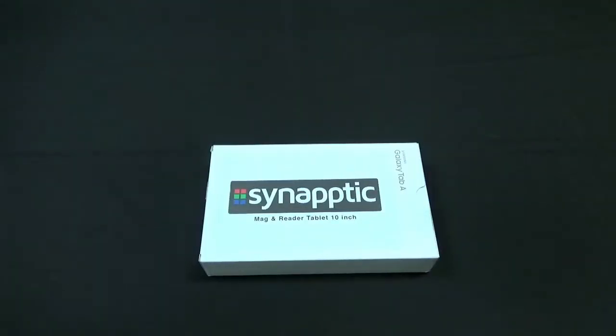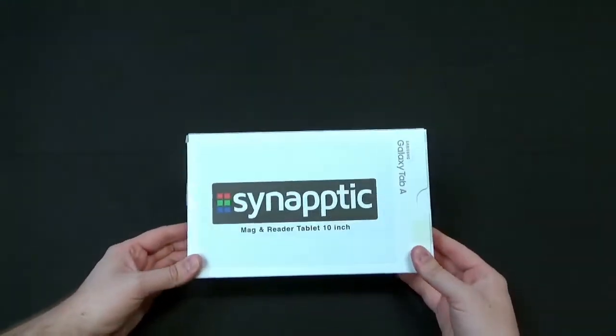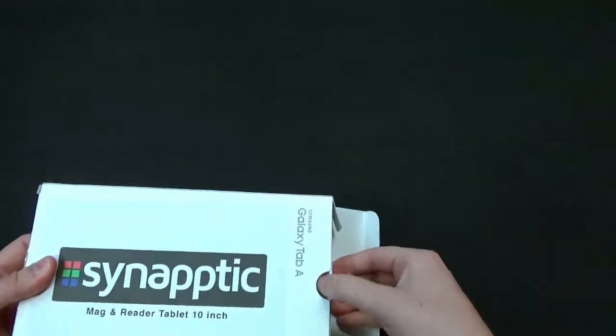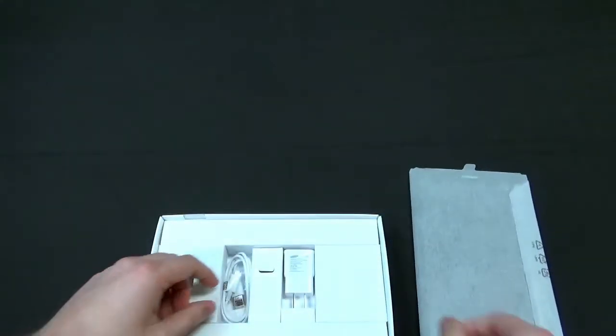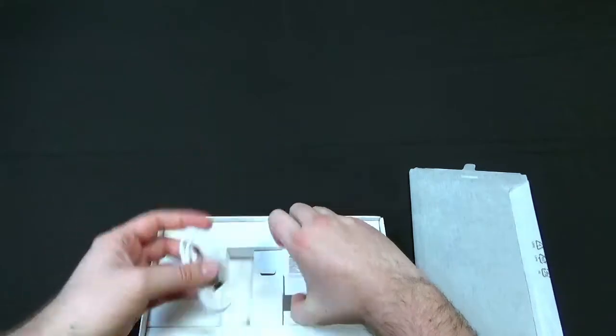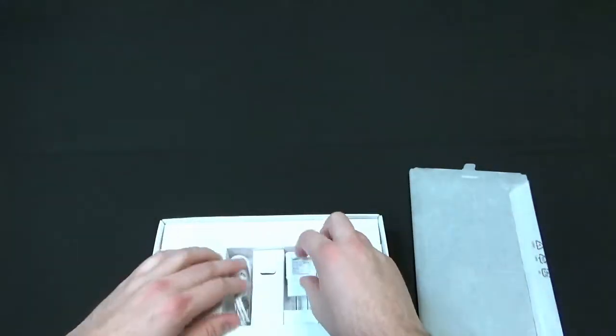Rather than talking too much about it, let's go ahead and dive in. We'll open up the box, see what's in there, and take a look at the device. Here we are up close with the Synaptic tablet inside the box. There really isn't much to see on the box, so let's break it right open, slide out our tablet. There's our tablet inside the sleeve. You also get a power cord and a little power brick for charging your tablet inside the box as well.